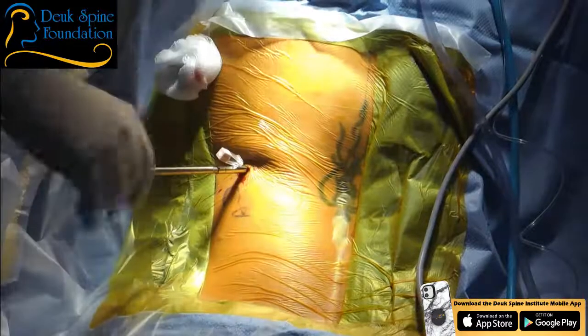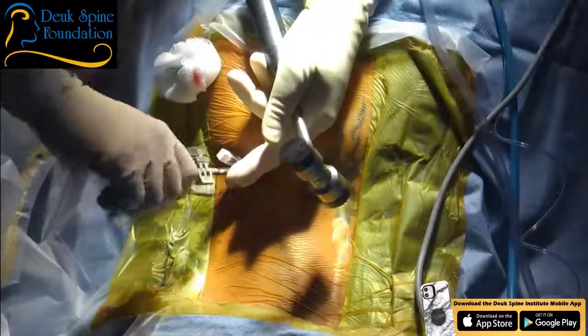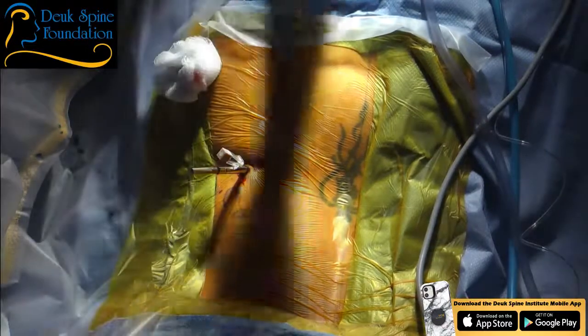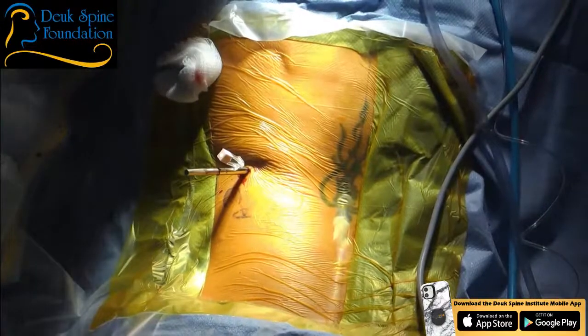Let me see where we are. I need to pull this back a little bit just to see. All right, looks like we're inside the disc, which is good. I want to verify that. There it is. We're inside the disc.